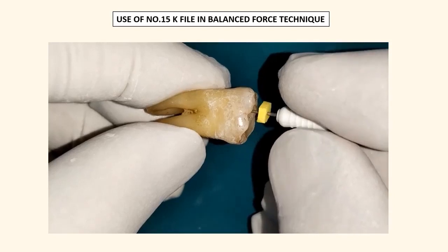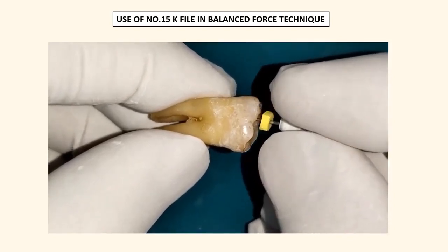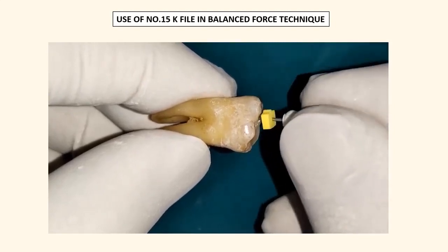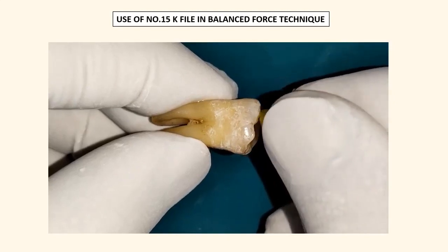90° clockwise, 270° anti-clockwise. 90° clockwise, 270° anti-clockwise, and at the end a 360° full clockwise turn and remove the file. This is the balanced force technique.